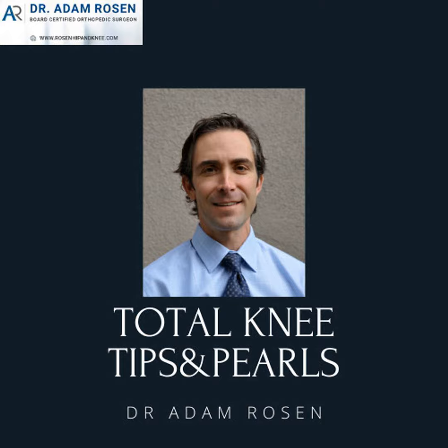The tibia for the most part is pretty straightforward, but like any revision, you need to know the tibial component — are there spikes, is there a flange, and how do you get around the back? The big thing is always trying to clear out posterior-laterally so that when you pull the tibia out you don't lose a lot of bone. Depending on the stability of the implant, you may try to sublux the tibia forward. With DFRs, it's a whole lot easier once the femur is out of the way, but always protect the neurovascular bundle and posterior structures. Once the tibia comes out, you can start building and trialing.